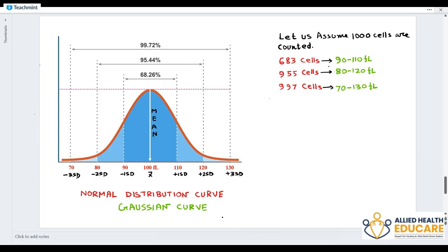So what happens in a normal distribution curve? Let's assume the machine counted 1000 cells, and the machine calculates the MCV. What is MCV? MCV means mean corpuscular volume. So here is a Gaussian curve.